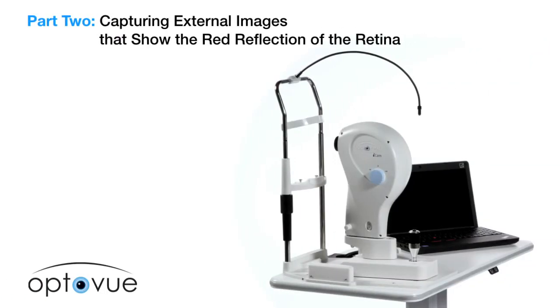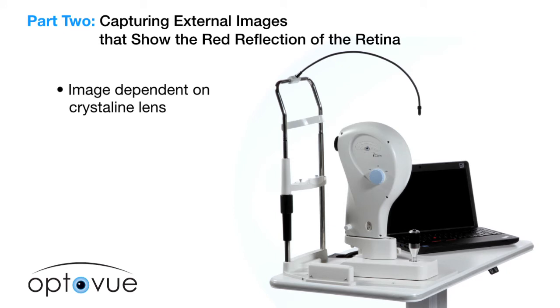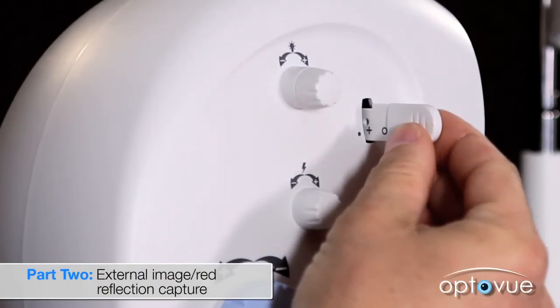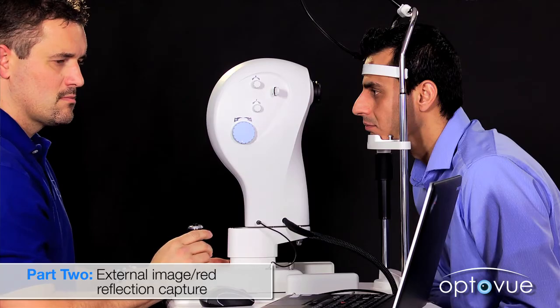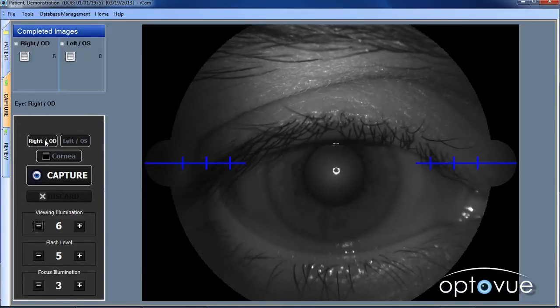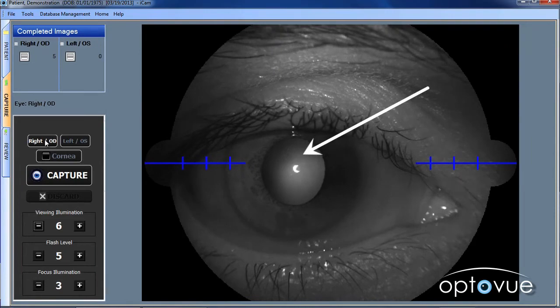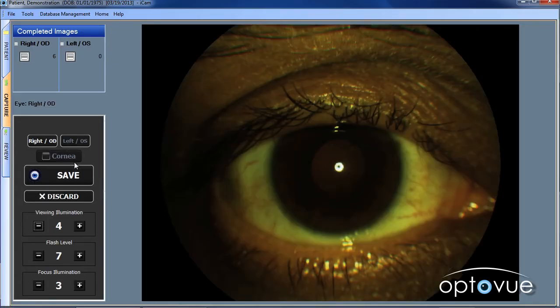Capturing external images that show the red reflection of the retina: the capture of an external image with red reflection is dependent on the crystalline lens — cataracts can block the reflection from the retina. First select the eye. Next, move the diopter compensation selector to the plus sign and turn the focus knob all the way in the plus direction. Push forward until the exterior of the eye comes into focus. Check the flash setting — five is a good setting to start, and it can be adjusted until the desired image is achieved. Make sure the patient is looking directly into the camera; the IR image inside the pupil will be brighter when the patient is correctly aligned. Ask the patient to blink and capture the image. Evaluate and save.